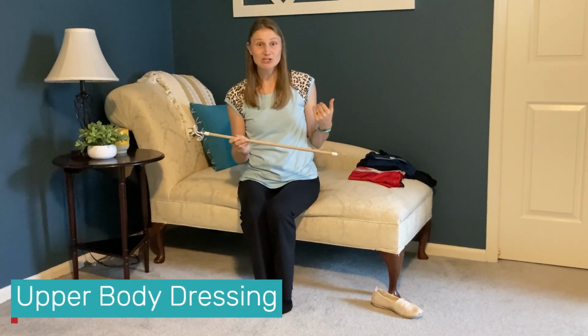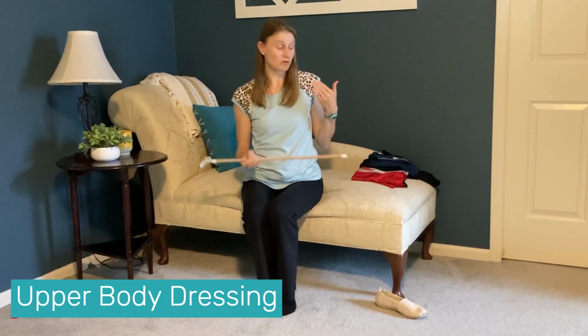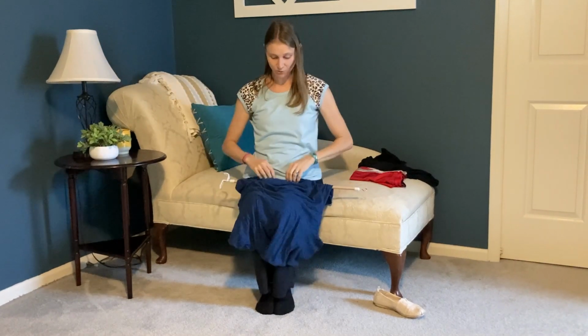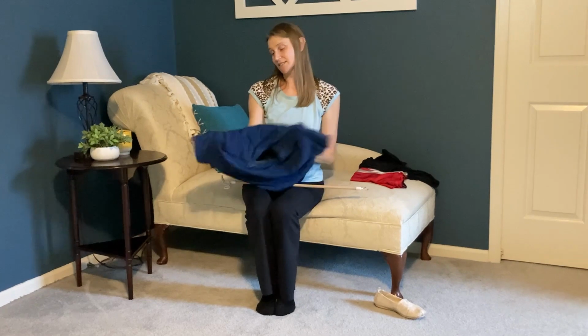So I'm going to go ahead and show you how to use this dressing stick first for your upper body. So for clients who have difficulty putting on their shirt, getting their shirt up over their head, this is how you can use your dressing stick to help with that.